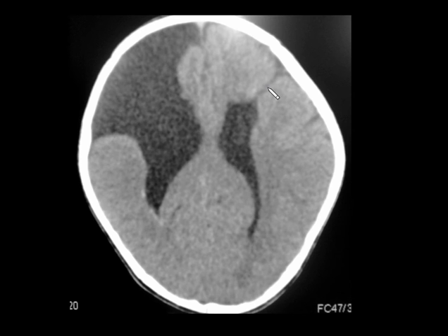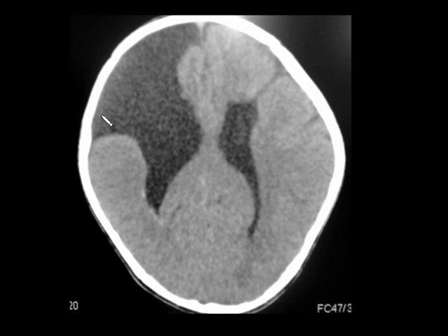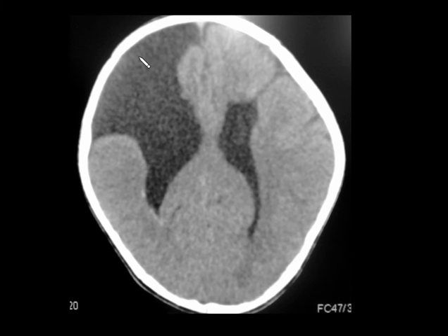Coming to the next case, you can see an abnormal CSF cleft extending from the ventricle to the cortical surface, and another abnormal cleft directly opening into the extraaxial CSF spaces. This is open-lip and closed-lip schizencephaly, both depicted in a single case.